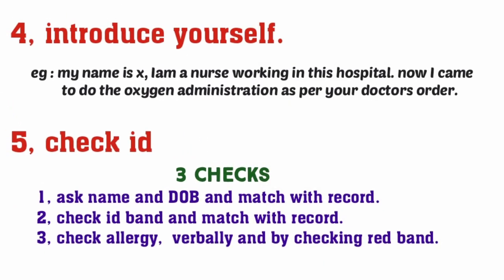Next, introduce yourself to the patient. For example, my name is X. I am a nurse working in this hospital. Now I came to do the oxygen administration as per your doctor's order.